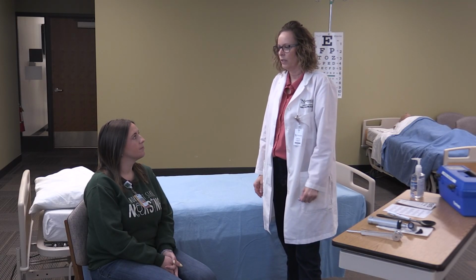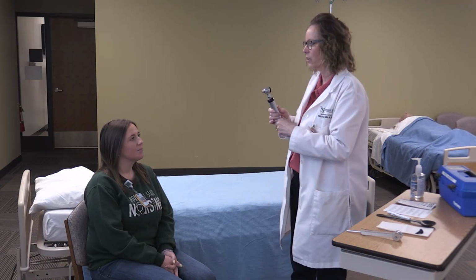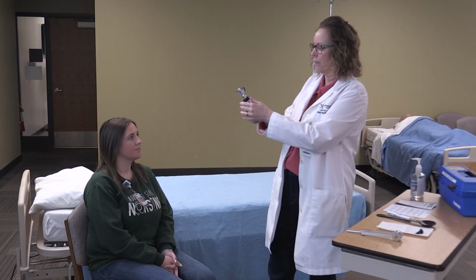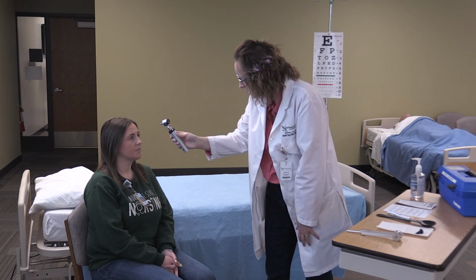All right, next, in each bed bay we have an ophthalmoscope, sorry guys. And this is obviously an otoscope, but in the bays we have an ophthalmoscope. You turn on the light and you're going to be checking the pupils for a red reflex. So you turn it on and you point it here, and you want to make sure that you see a red reflex, red or orange reflex in the pupil. And you do that on both sides. And you turn it off.